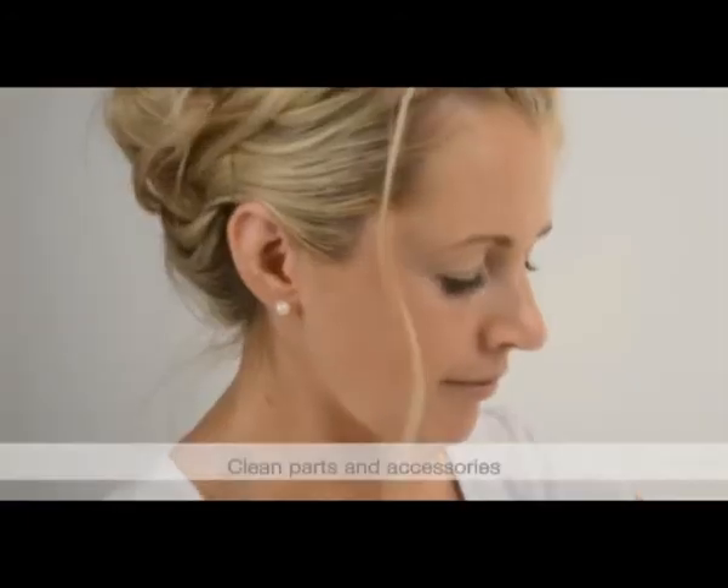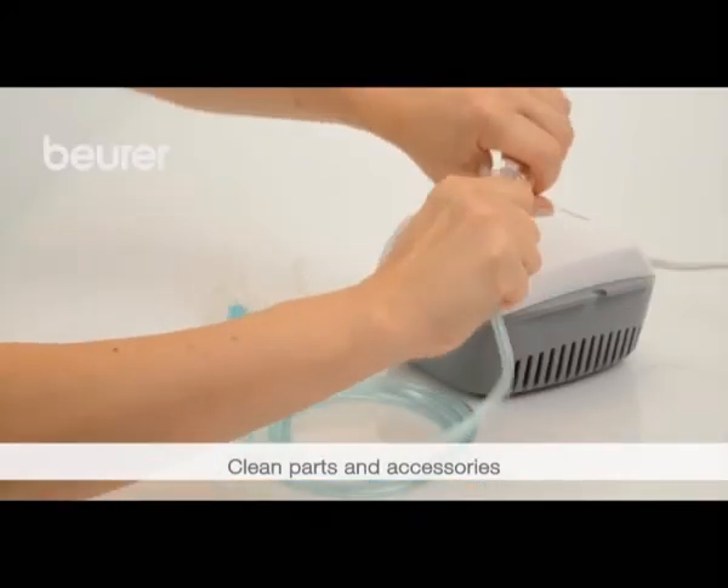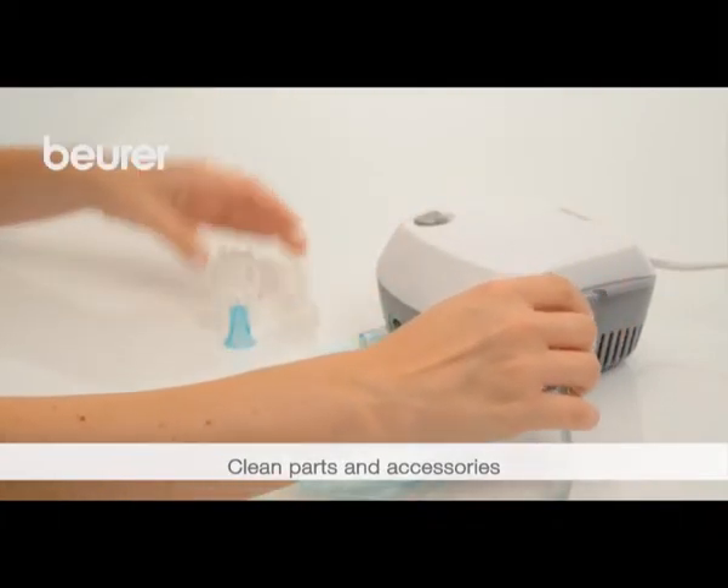Clean and disinfect all parts and accessories of the nebulizer before first use and after each treatment.